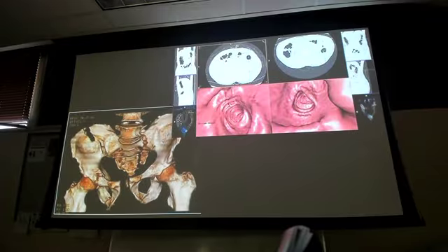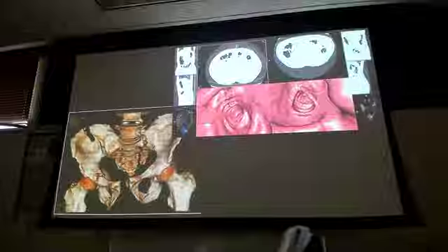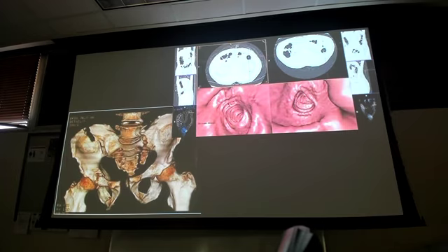And then this is one of the areas where the 3D remodeling is really nice, pelvic fractures. So we got pelvic fracture here, and then here in the pubic symphysis, that's separated. With pelvic fractures, there can be a lot of fractures going on in the pelvis that even with a CT might not necessarily stand out until they make this 3D reconstruction. They go, oh, it's not supposed to bend that way. Okay, let's figure out what's going on here. There's probably another one here in this SI joint over here maybe. I would want to draw my attention to it. Some sacral fractures. So there's quite a bit going on in this pelvis.